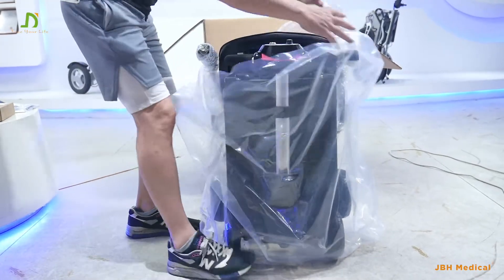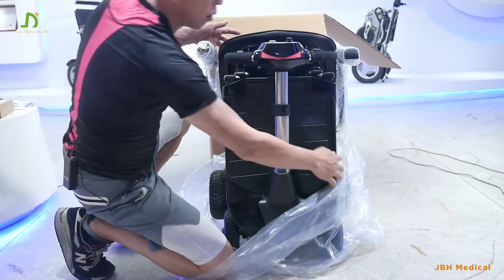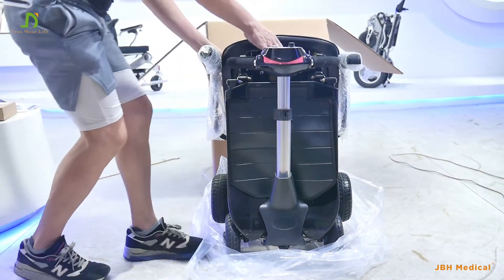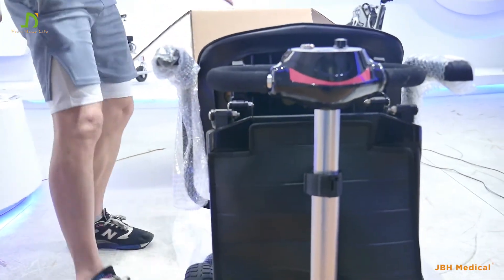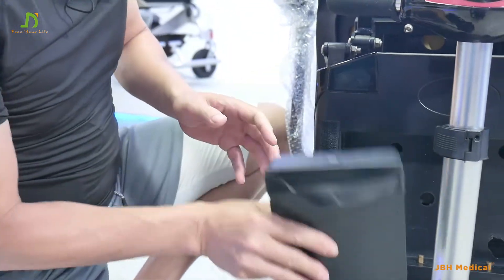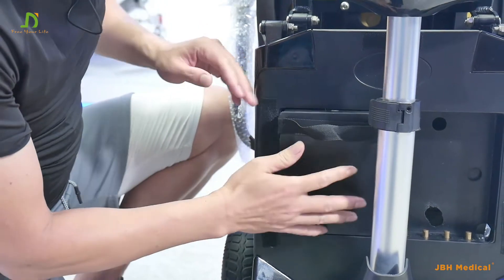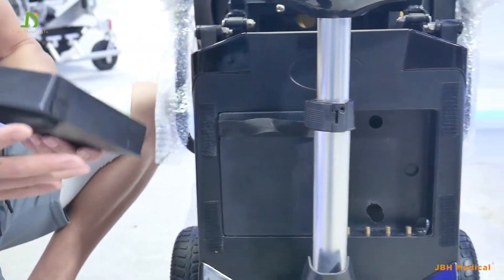Take off the plastic. Then we can just simply drag it out — that's very simple. Let's insert the battery here. Make sure the four ports of the battery are facing down, and insert it here, and another one here.